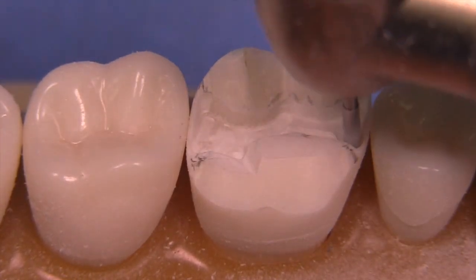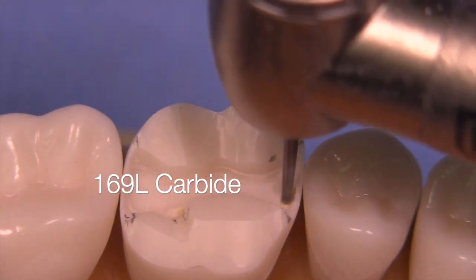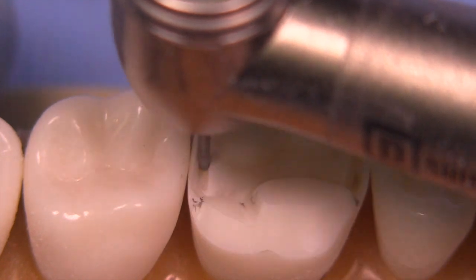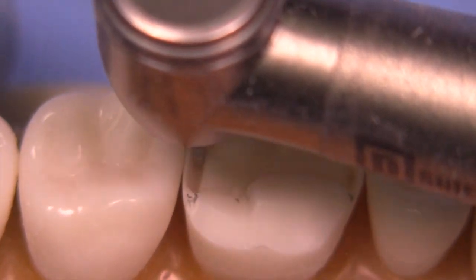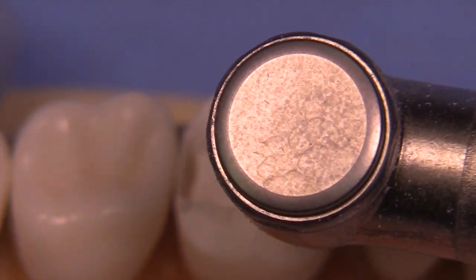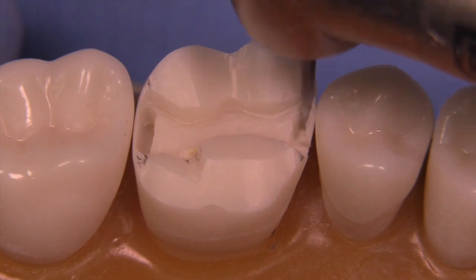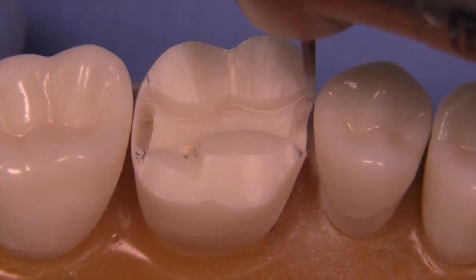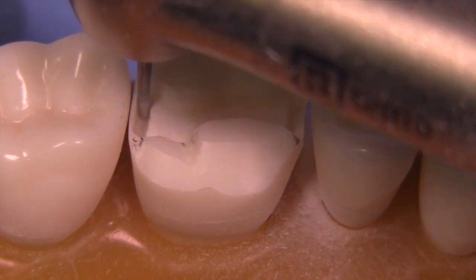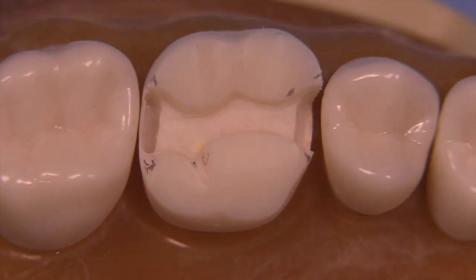We're now ready to drop the boxes. We'll use a 169L and make a little slip down the middle, leaving a little piece of tooth structure on the side to protect the adjacent tooth from being damaged. We need to have a one-millimeter-deep axial wall — the width of the gingival floor is one millimeter. We push the burr gingivally far enough to break contact, remove caries and old restorative material, leaving an axial wall height of about three millimeters. I like the 169L because it's skinny and you can fit it into areas without worrying about hitting the adjacent tooth.